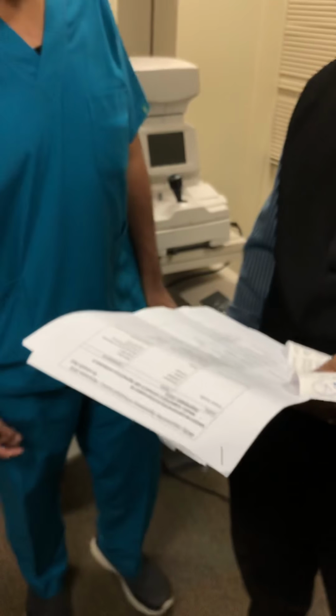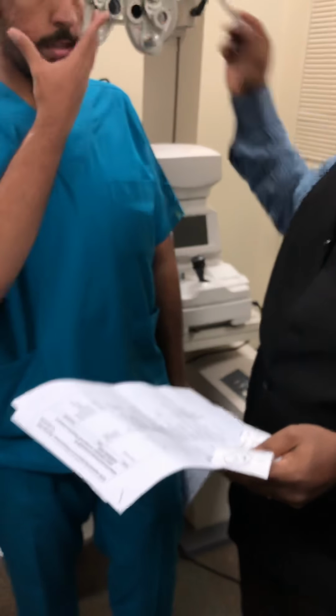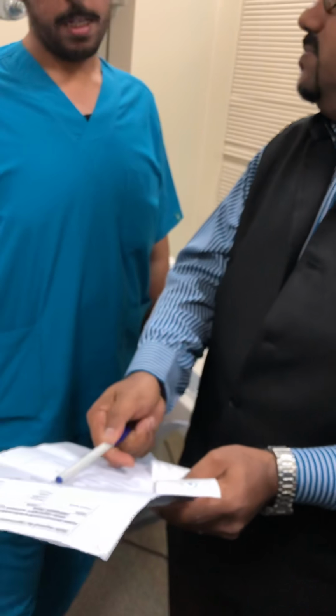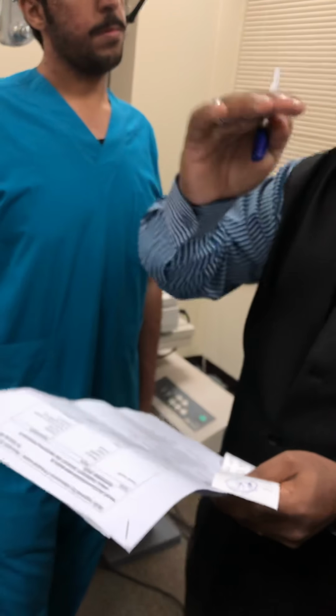If he is -3, it will be -2, and you fog like that. And then decrease it until we see the maximum plus for maximum visual acuity. That's what you call MPMVA. With the maximum plus lens, he sees 6/6.